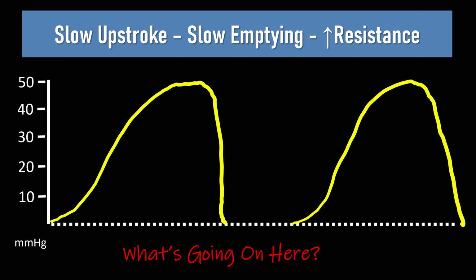And this is a really characteristic waveform, and it's something that you must be able to identify, because it helps you diagnose and actually follow the treatment of increased airway resistance or acute severe bronchospasm that may occur at any stage in the management of patients in perioperative medicine and critical care.